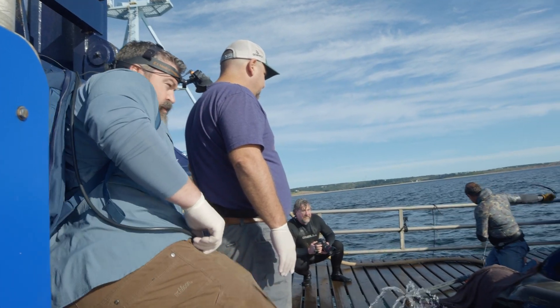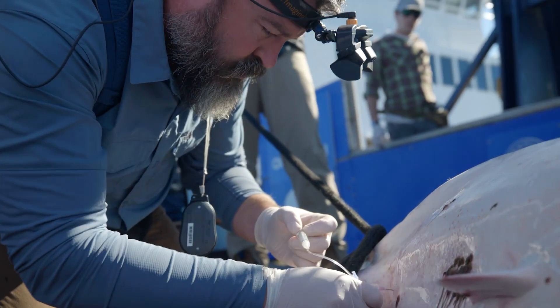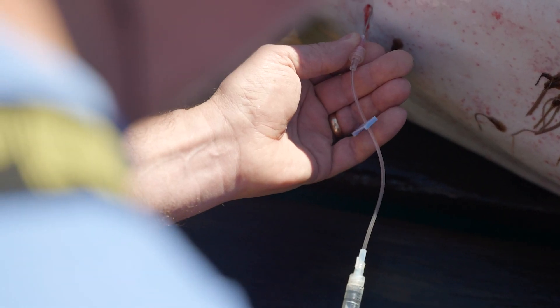I'm Dr. Mike Hyatt, one of the veterinarians at Wildlife Conservation Society's New York Aquarium, and I'm one of the science team members out here on OCEARCH. As part of the science team, we're collecting a lot of different samples from these white sharks once we get them onto the lift, and one of the most important samples that we collect is the blood.